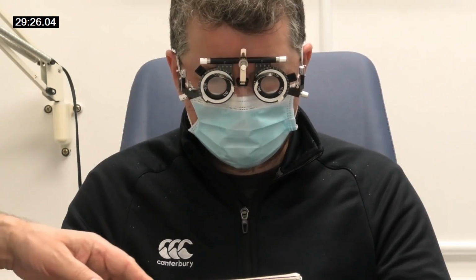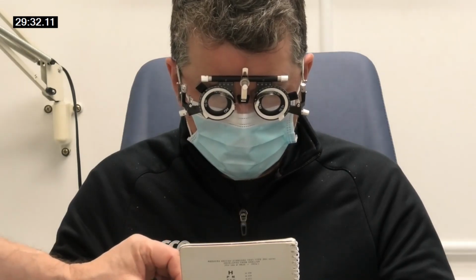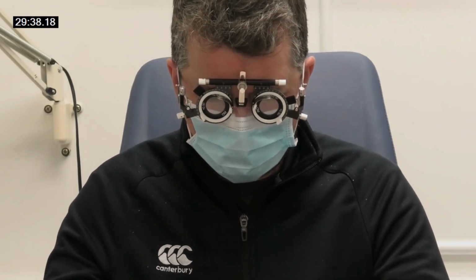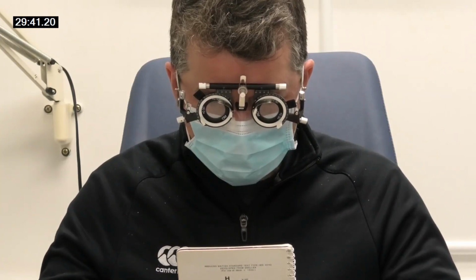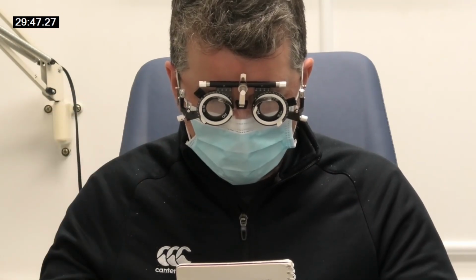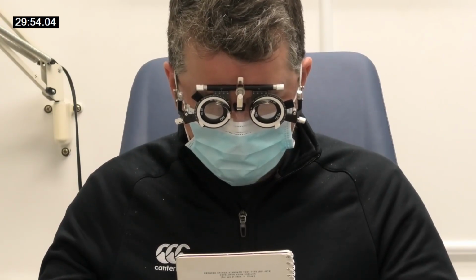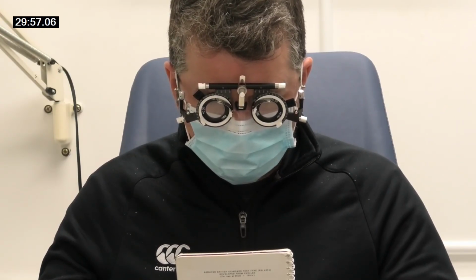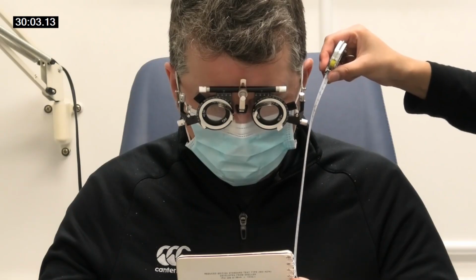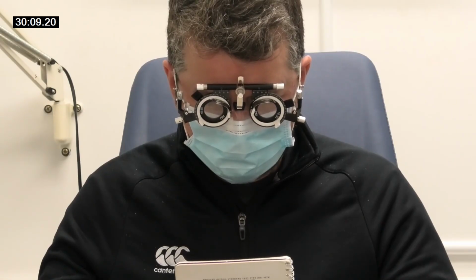So if you bring it slowly closer to you until it just goes out of focus. So here. Just going, the edges going there. It's clear there, is it? Yeah. And definitely clear there, yeah? Yeah. And just bring it slowly up until it goes out of focus. You can take a seat back now. So because the string lines are in here. Just about there, yeah? And how many diopters is that? Let's have a ruler. Around 30 centimetres. So that's 3 diopters, isn't it? That's 3.25 or something like that.